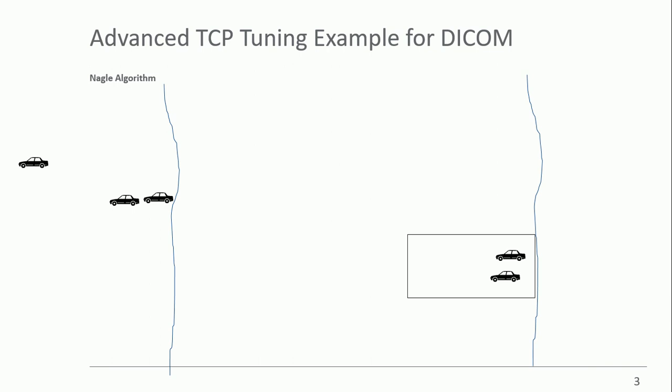In Unix, you can go in and adjust how this works, and you can really tune to get much faster speeds. So sometimes if you're wondering why you've got two DICOM systems that are in similar environments, and one's really fast and the other one's not quite so fast, and everything else is equal, this is one of those little things that you might have to look at. There are other things in TCP. I would encourage you to learn more about TCP and how it works, because there's lots of other little settings that we can look at in TCP that would affect performance on a network.